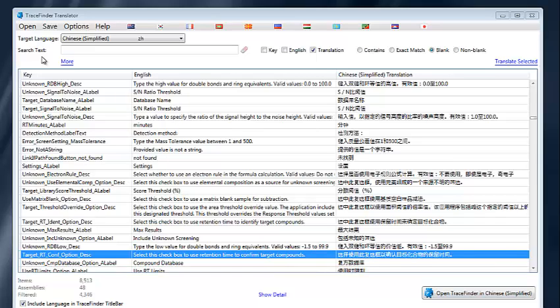Basically, what this application does is solve a problem that exists in translating applications, which is the need to have both developers and end users involved. It allows the end users themselves to interrogate which resource strings are available for translation, and then translate those and start TraceFinder in that target language.